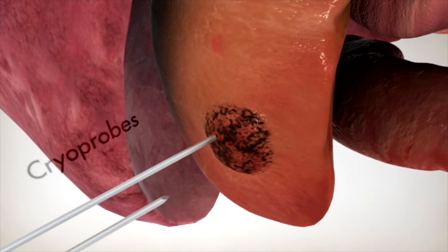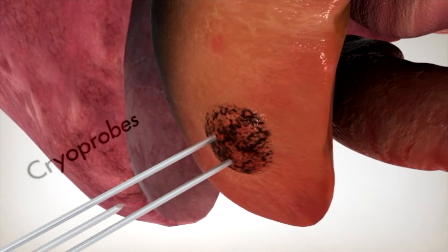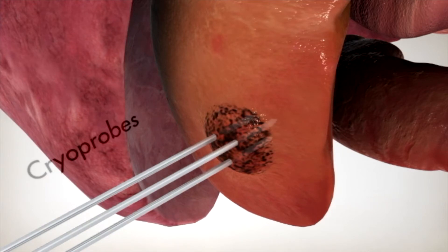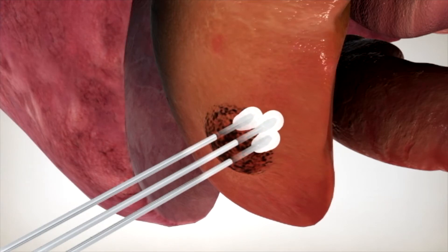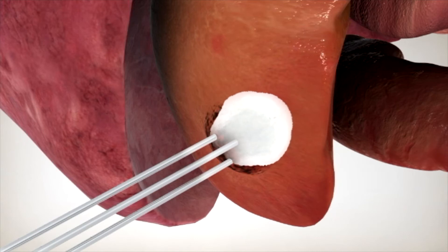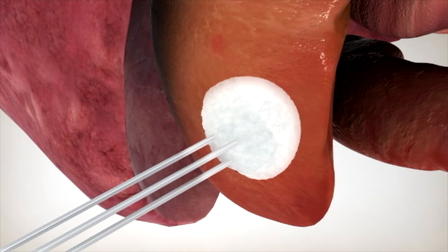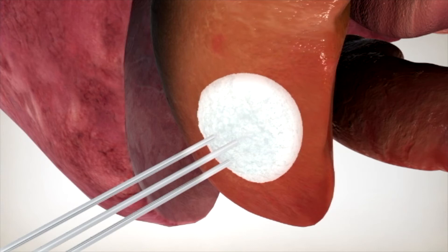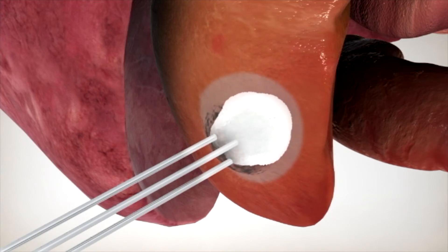The freezing process is the same as for when a patient is laying face down in the CT scanner. Argon gas is circulated through the cryoprobes to freeze the area. Temperatures of minus 40 degrees Celsius are achieved and a double freeze-thaw cycle is used.